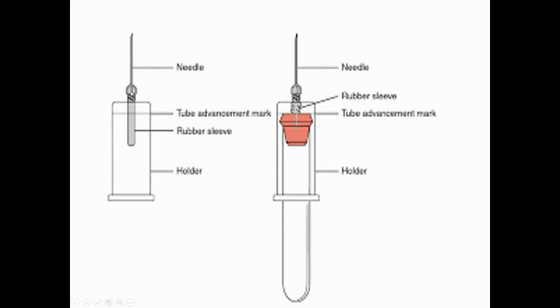So this is an example of the needle. Another needle, but with a rubber sleeve. Here is where you put your adapter, because the purpose of this needle with rubber is that this is where you insert your tube. By the time you place the tube there, the blood automatically flows into the tube. With a syringe, you can see the blood inside, but with the evacuated tube, by the time you place the tube, you know that you have hit the vein. And if there is none, remove the tube or reinsert your needle, meaning you probe again with your needle.